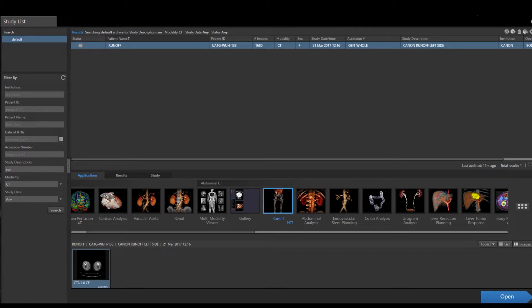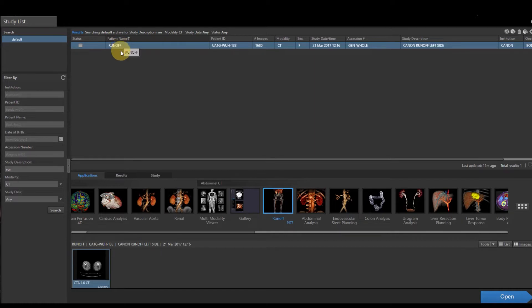First, what we want to do is select our patient. We're going to left click on our patient. When you left click on your patient, directly below you're going to have an applications, results, and study tab.